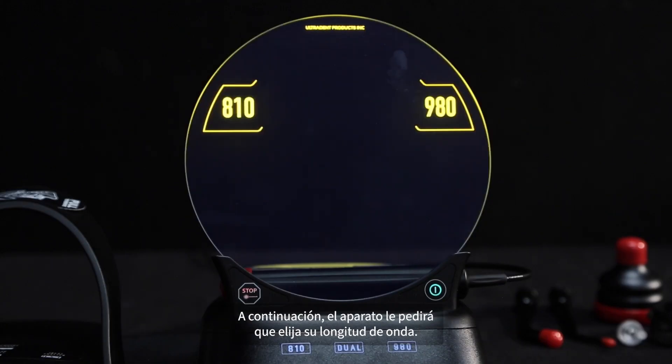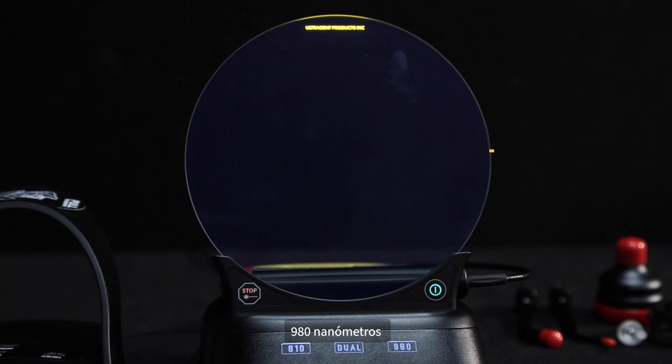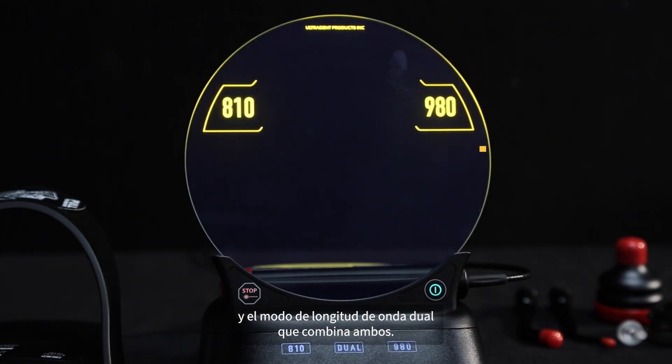The unit then prompts you to choose your wavelength. There are three wavelengths available: 810 nanometers, 980 nanometers, and dual wavelength mode combining both.